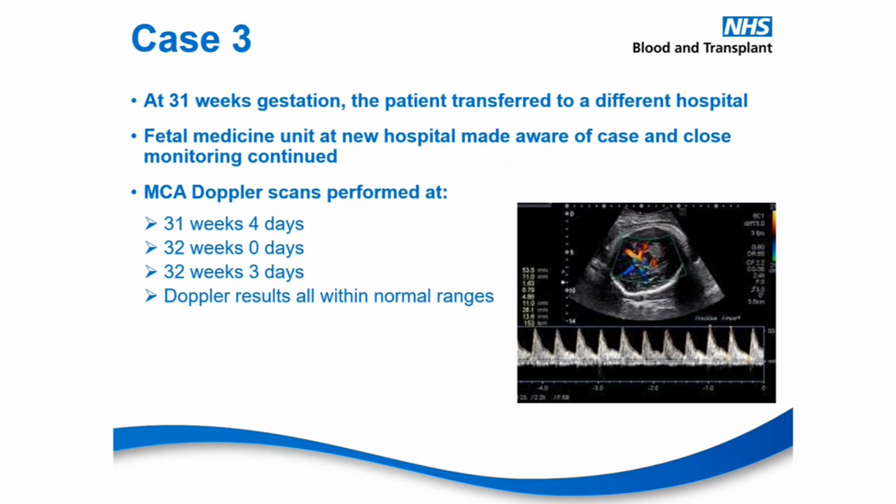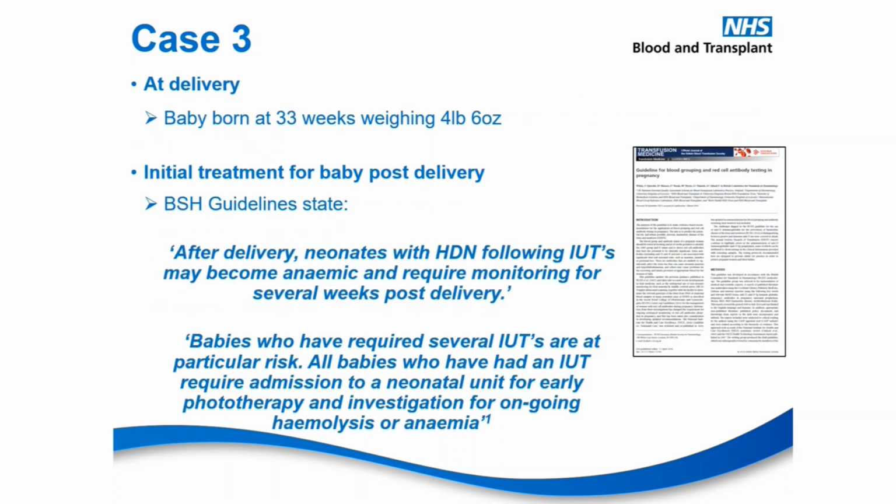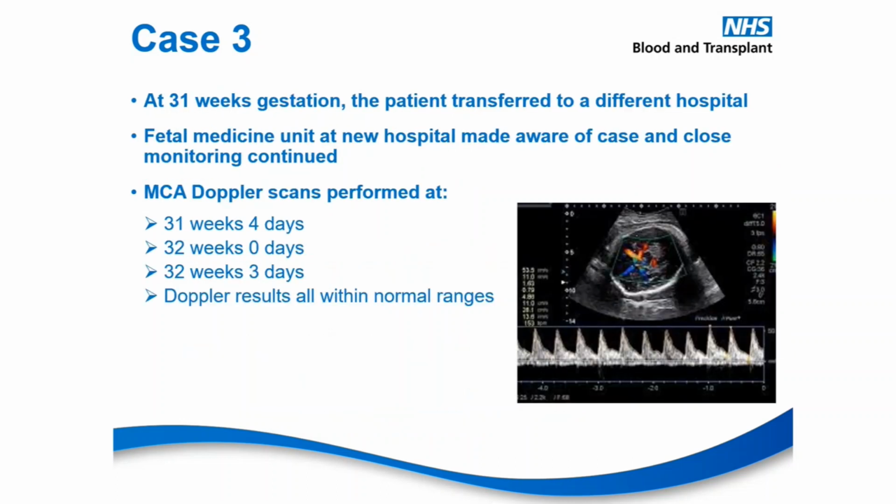So in relation to this case, at 31 weeks gestation, the patient transferred to a different hospital. So this just further clarifies the fact that it's essential for communication across the FMUs, and the FMU unit at the new hospital was made well aware of the case and the close monitoring continued. So the MCA Doppler scans were performed at these intervals that are listed here, and the Doppler results were all within normal range, which was obviously great news for mom and baby, all the teams involved. So our results were reported to the NHSBT clinician, the referring hospital blood bank and the fetal medicine departments.